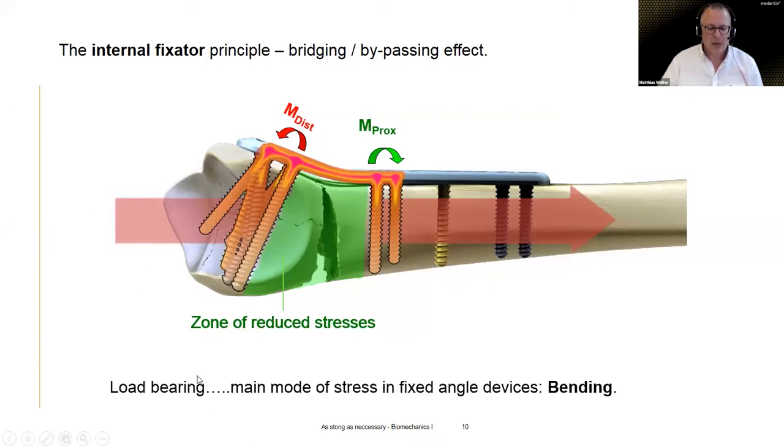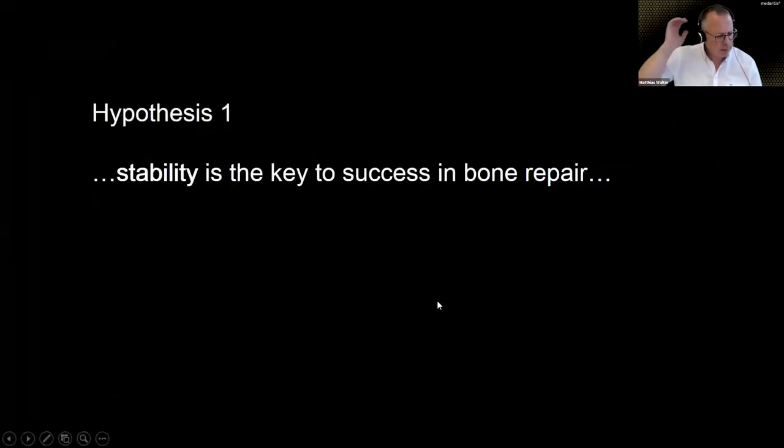All right. Now, load bearing means this implant has to take load all the time because you have your flexor and your extensor tendons obviously pulling on both sides, on the dorsal aspect and then the volar aspect, which means you have a constant load on your joint, which means that there is always bending, or if the force is applied offset a little bit, you can also have torsional loads as well as shear loads, etc. Now, maybe you remember this from last week.